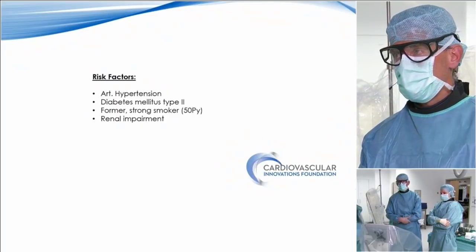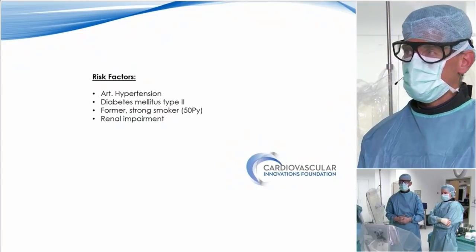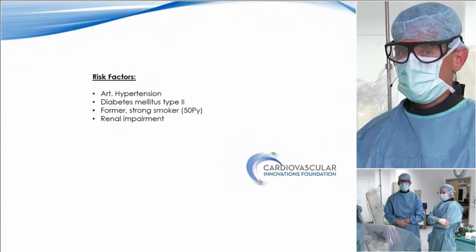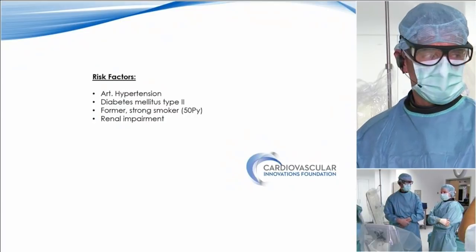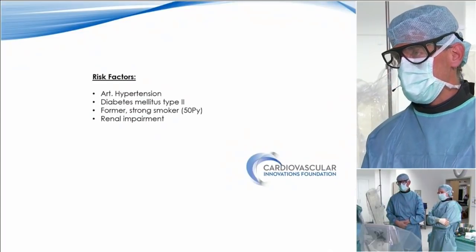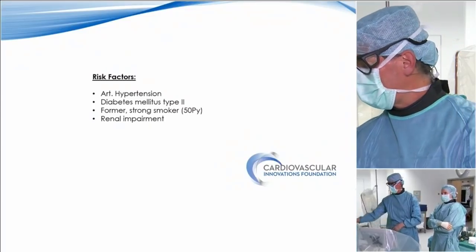So we have tried CT, and if there is no calcium, it does not really help you. Ultrasound, there is a lot of scar. The visibility of the structures, I think, is not easy. MR also not really, haven't had the feeling that it's very helpful. So therefore, we just try it, and maybe we have success.